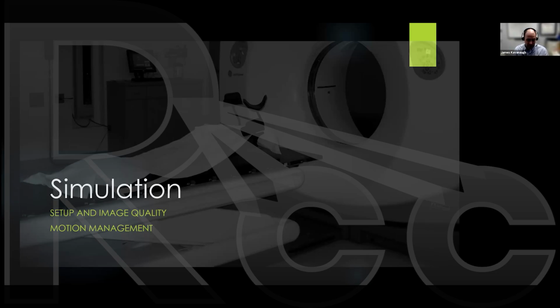For intact prostate SBRT, it really comes down to what our margins are. If we're working with very small margins, which we've been moving more and more towards, that variation may be something we want to control. I have some images further on where on one day there's hardly any bowel or any stool in the rectum, and the next day there's a massive amount. And then even over the course of treatment, it can change. And those are the concerns we're thinking about. So longer treatments, smaller margins is something where we definitely want to talk about bowel prep with an enema. Otherwise, no, we really don't control for it in the conventional fractionation paradigm. Bladder, though, we do. We do have instructions for bladder filling that we try to be consistent with.